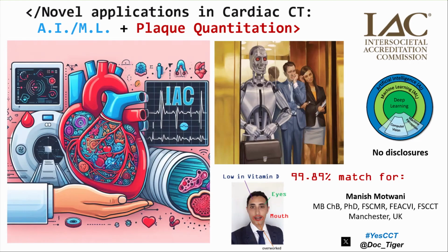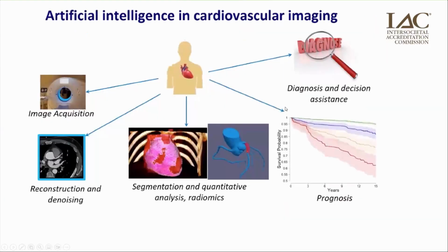So how does artificial intelligence, where does that fit in cardiovascular imaging? Well, actually, AI in cardiovascular imaging has a role to play in every aspect of the cardiovascular imaging workflow. It can certainly help in image acquisition in terms of speeding up image acquisition.